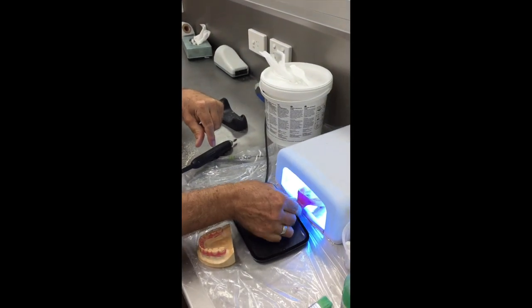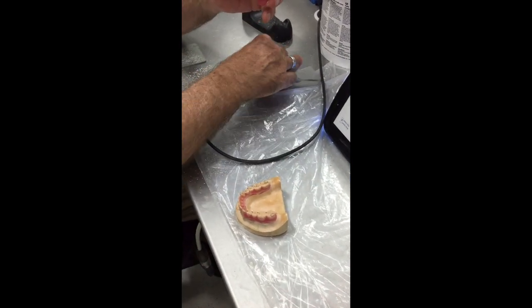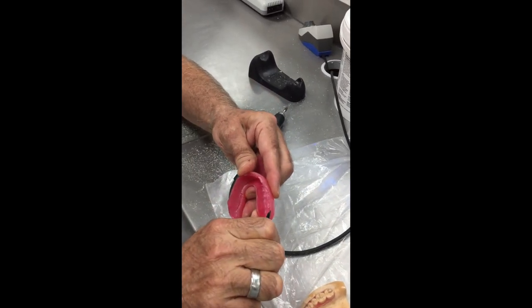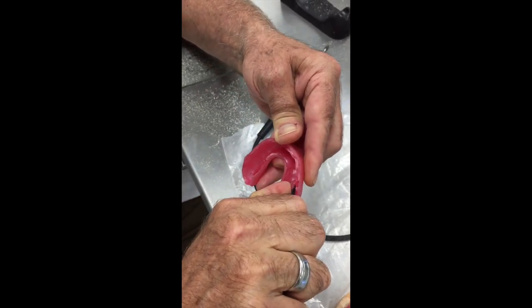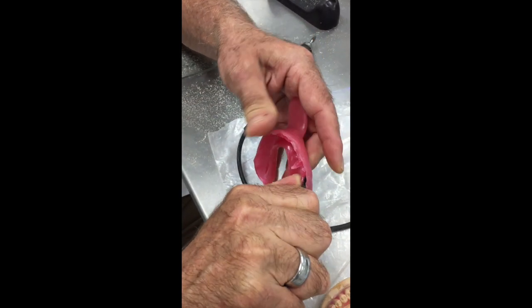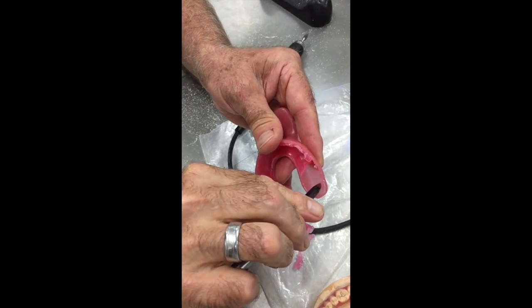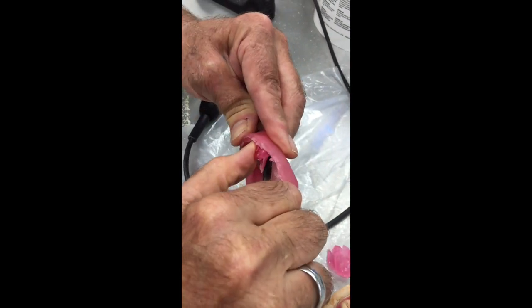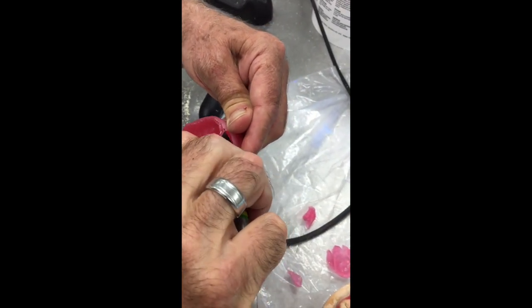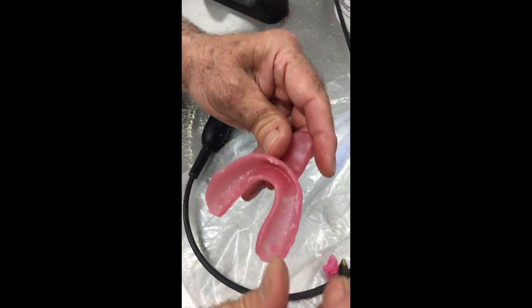Okay, so we've now taken the tray off, we've turned it over, and we've cured for another minute on the inside like so, and we're ready now to take the wax spacer out of the tray. So we're just going to go around and lift that out, and hopefully it will come out in one piece, particularly if the tray is still a little bit warm from being under the light. And you'll see now that we've got these tissue stops that are nicely cured, because we reversed the curing, lifting out all traces of the wax. And we end up with the tray that's finished like that.